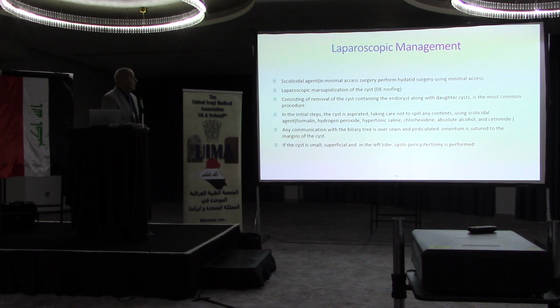Laparoscopic management: as we know from the literature, it's a minimally invasive surgery, and laparoscopy is very helpful in dealing with this problem. It consists of the removal of the endocyst along with the daughter cysts. The most common procedure, the initial step, is aspiration, and I have movies here of the operation.